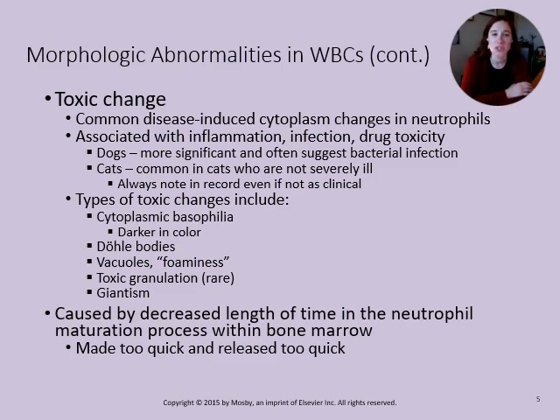We can see what's called toxic granulation. This is rarer than the others, but it's still possible. So if you think about granulocytes, they already have granules in there, well, actually those granules can get a little teed off and they can be toxic. Okay, so that's toxic granulation. Don't get that confused with an eosinophil, though. We'll pop up some pictures here in a minute.